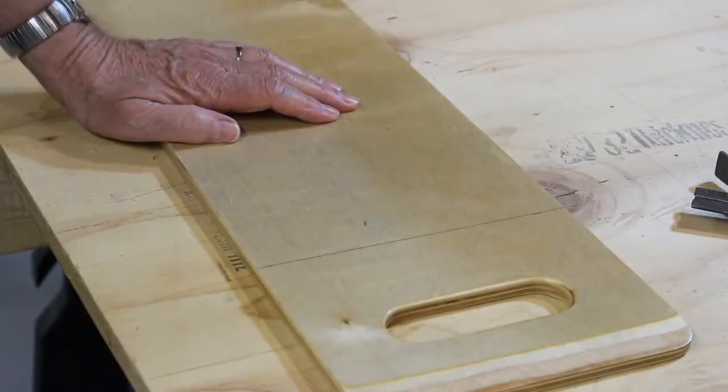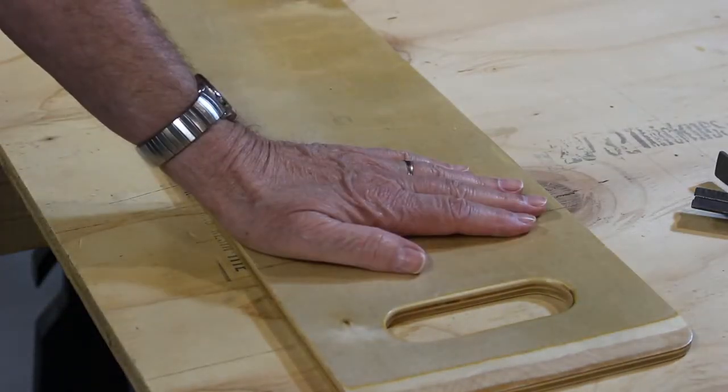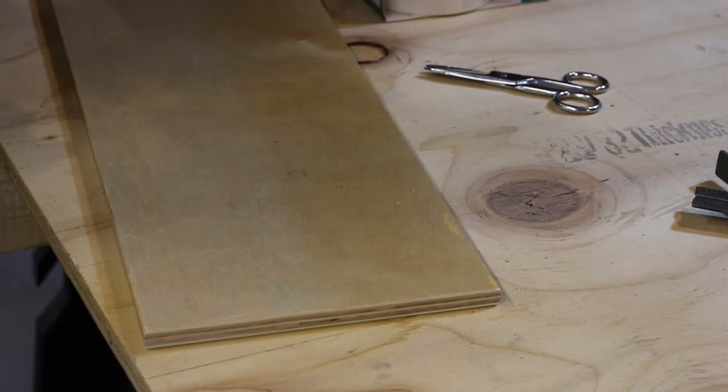I'm going to go over to the saw and cut this off. There's the piece I cut off.